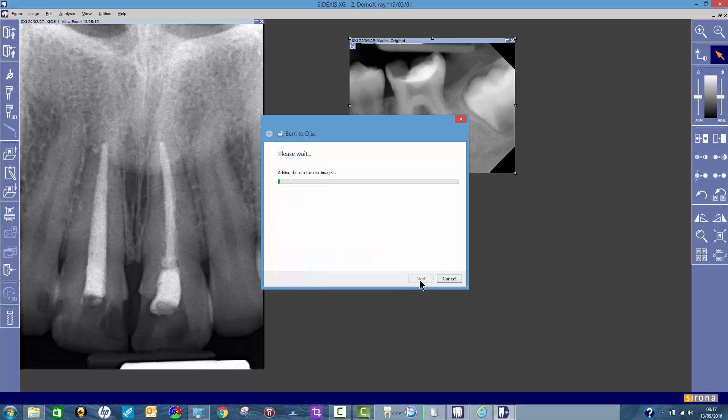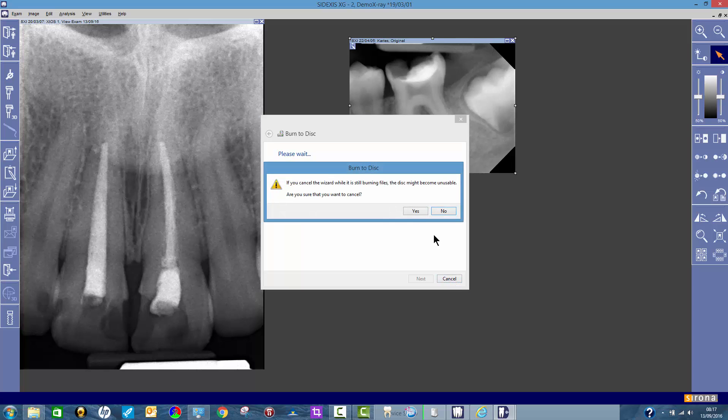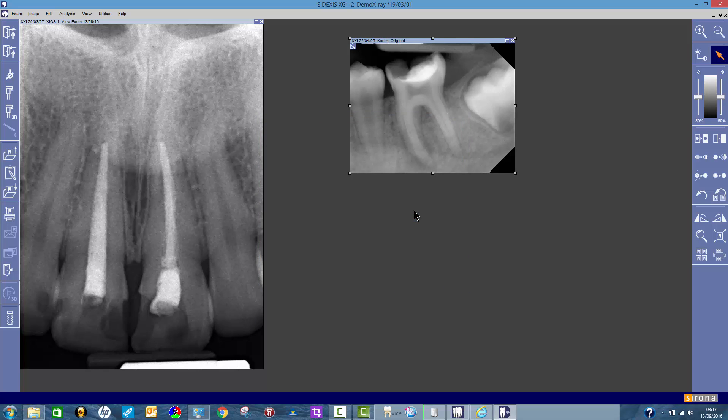Yours might look slightly different to this because this is how my particular laptop does this. I'm just going to click cancel because I've already done this, but yours would just go through that process. This takes a couple of minutes and it will have burnt it to disc. I'm going to say yes, but I did do this earlier.